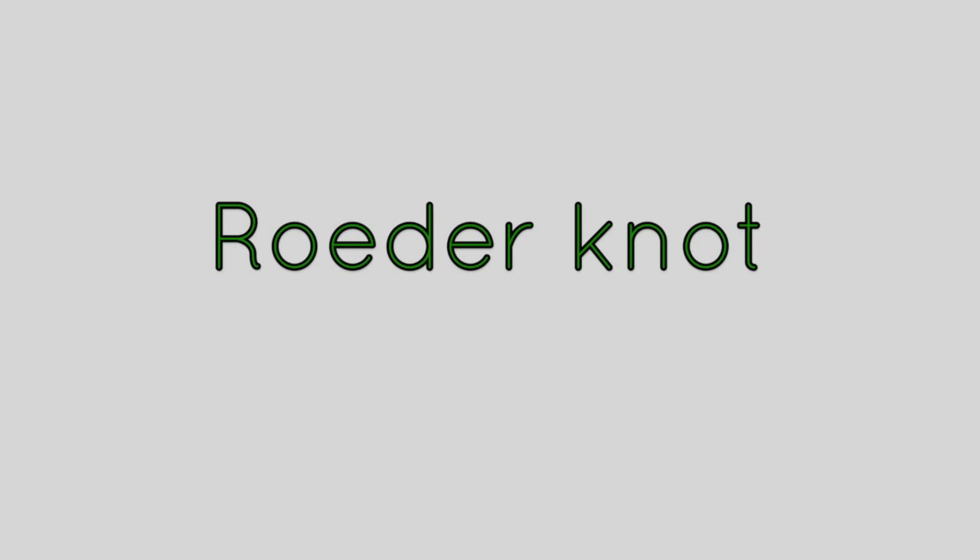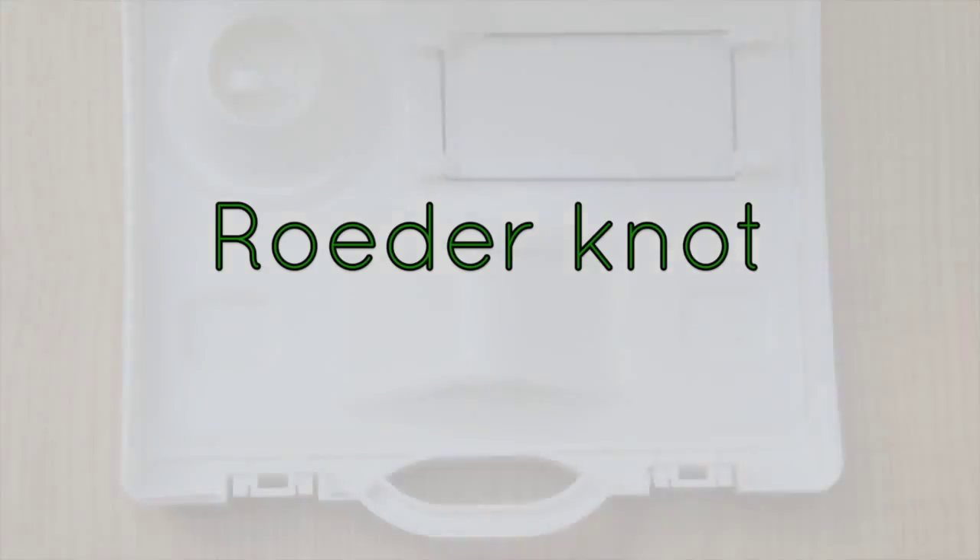We're going to show you here how to tie a Roeder knot, which is part of the extracorporeal knotting module.